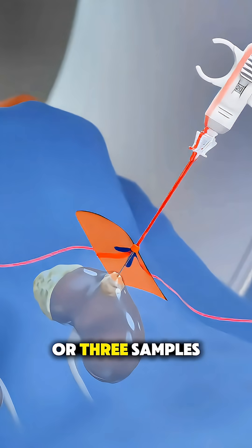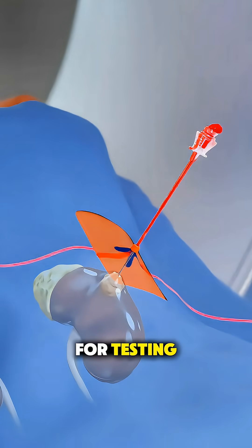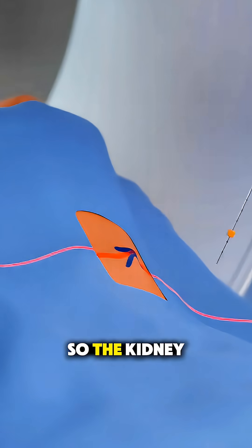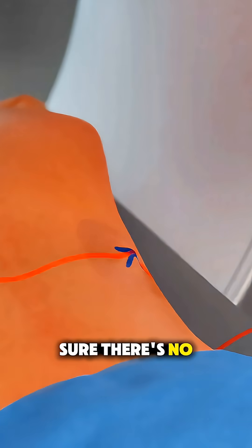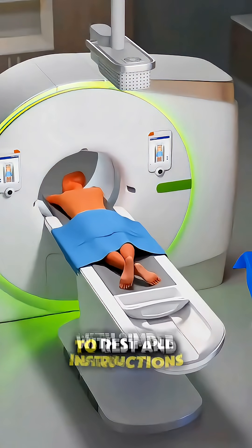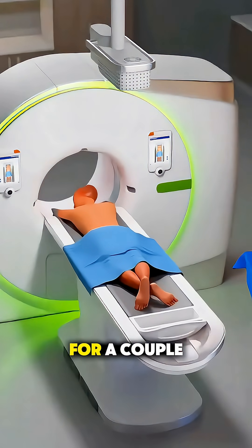Sometimes they take two or three samples to make sure they get enough for testing. After the biopsy, you'll lie flat for a few hours so the kidney can settle and to make sure there's no bleeding. Most people go home the same day with simple instructions to rest and avoid heavy activity for a couple of days.